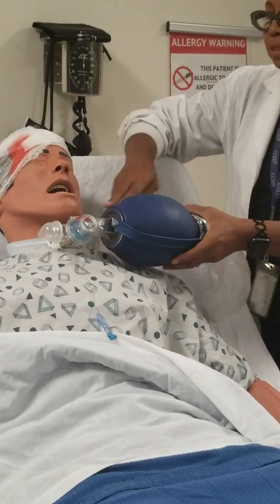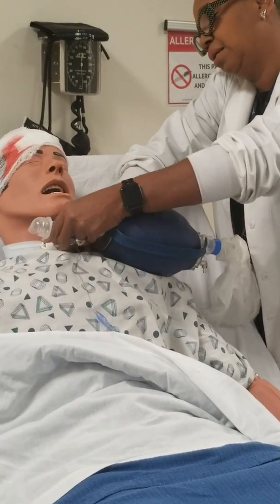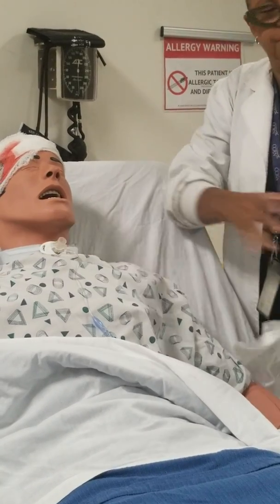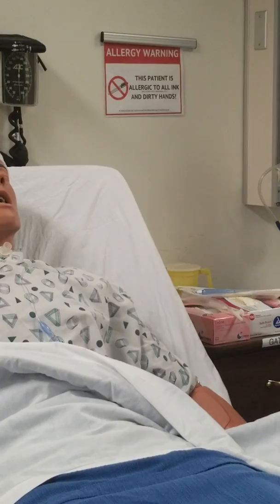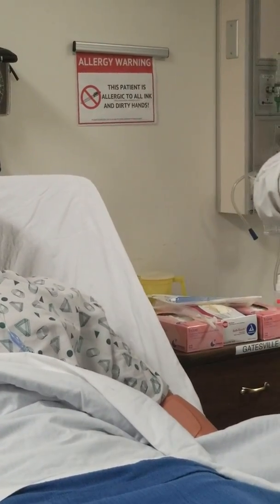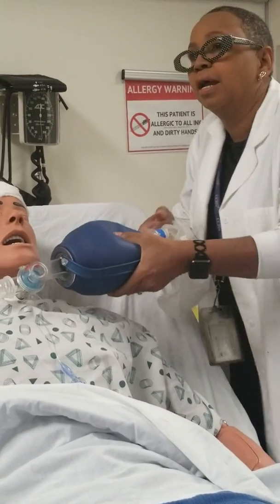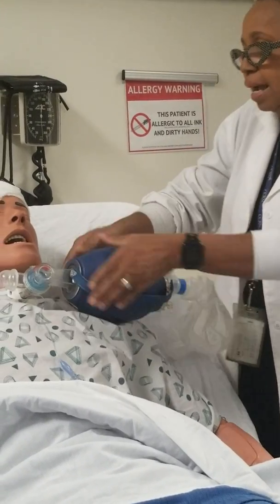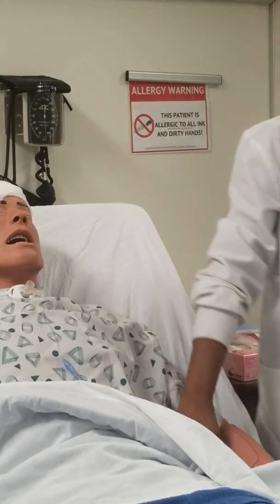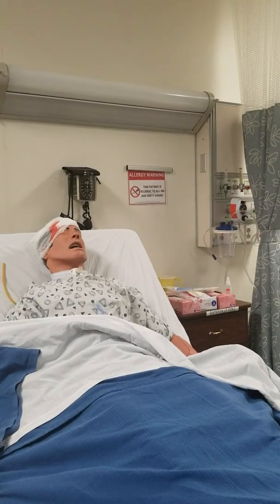So the biggest thing with this is that it's a bag mask oxygen device, okay? People are like, oh, I'm bag. Ooh, that's so funny. Take it off. Connect it to there and then bag it. Does that make sense? Okay, that's hyperoxygenating. Like I said, you may or may not have to do this, but this is how you would do it.